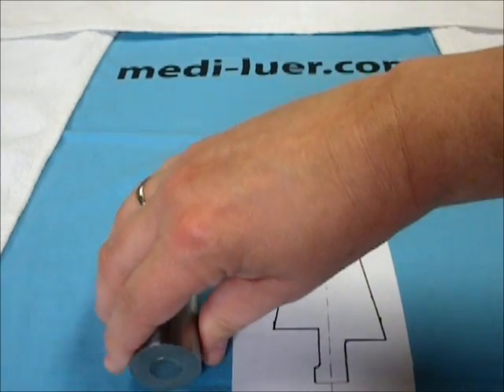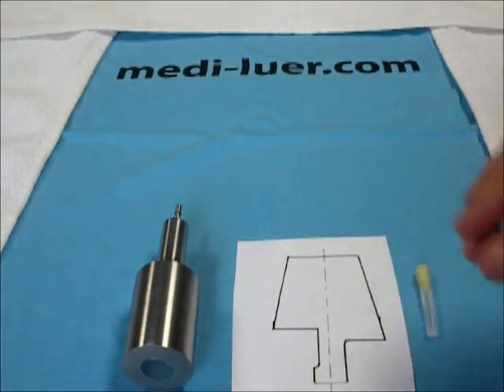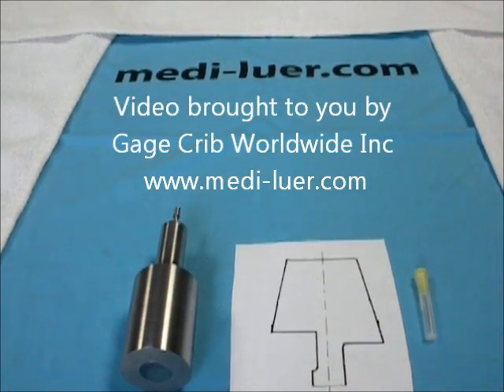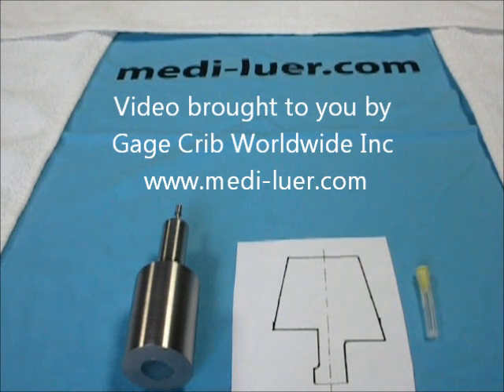And that is all there is to making this test. You have just completed the instructions for an ISO 594-1 figure 3C plug gauge and how to use it correctly with the 5 newton weight.